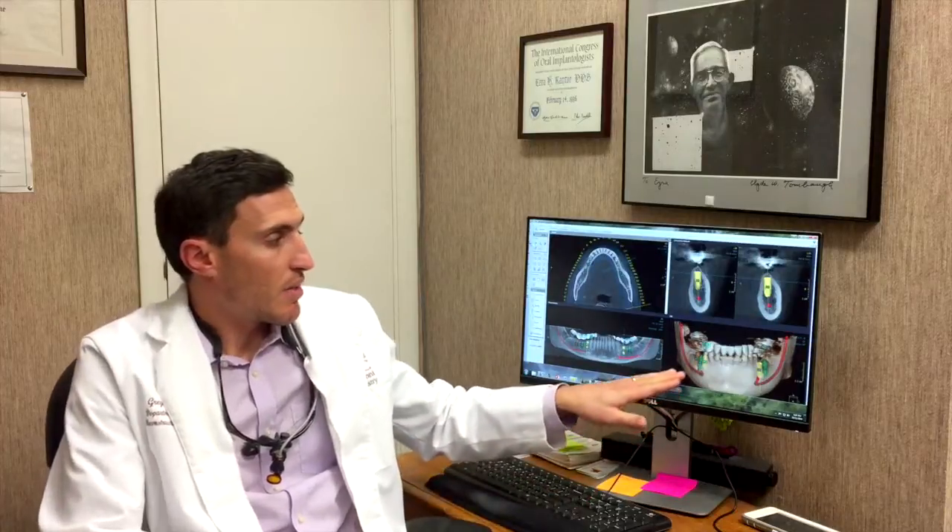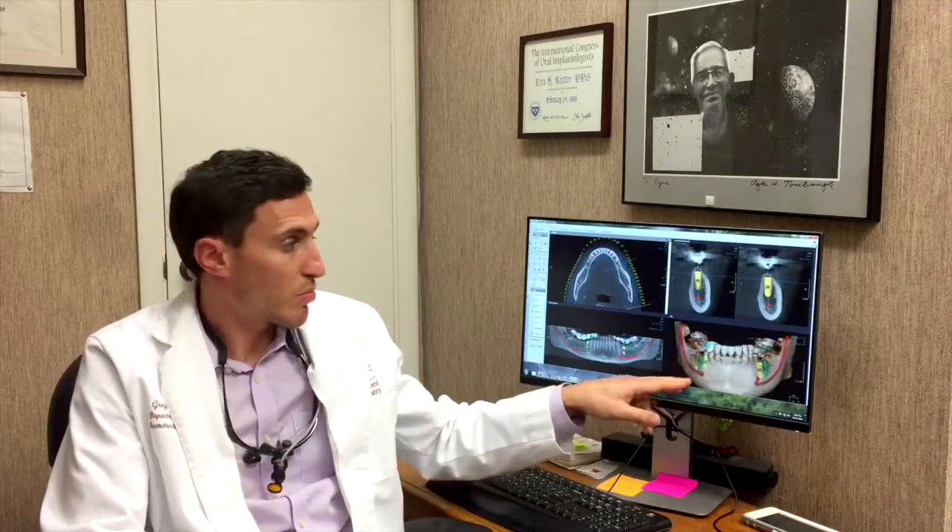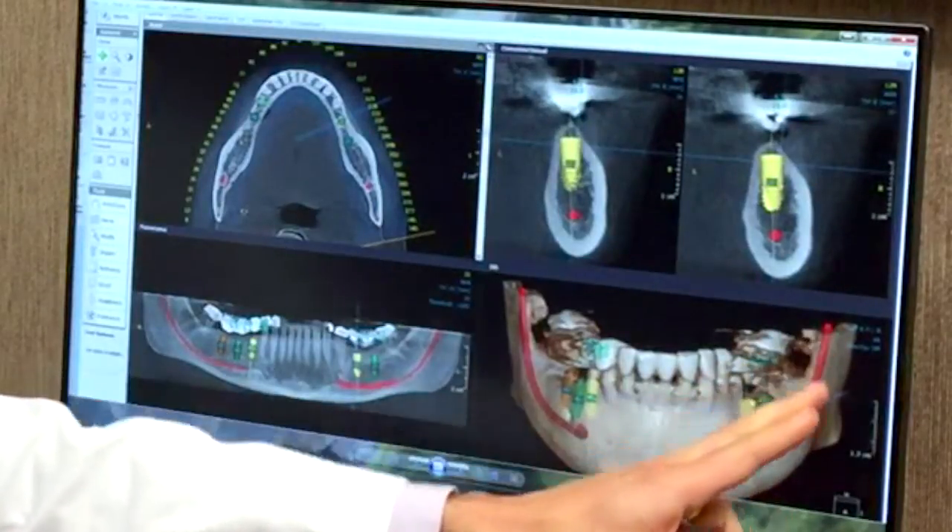When working with implants, there are some anatomical structures that can be dangerous to come across when you're screwing in the implant. So an important thing is to watch out for these anatomical structures — one of which you see here as this red line.